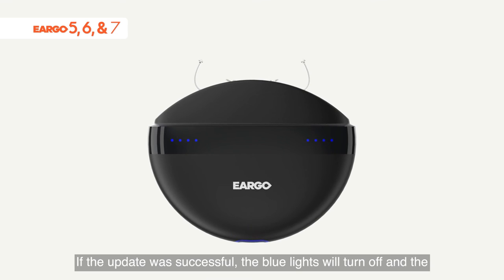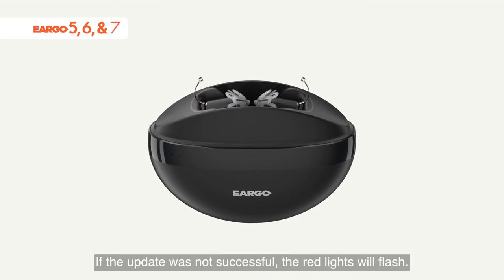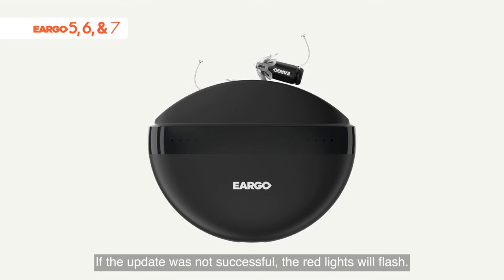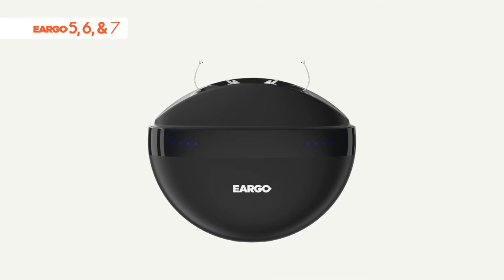If the update was successful, the blue lights will turn off and the white lights will show the current charge state. If the update was not successful, the red lights will flash. Remove, then replace the device in the charger to dismiss the red lights and retry.